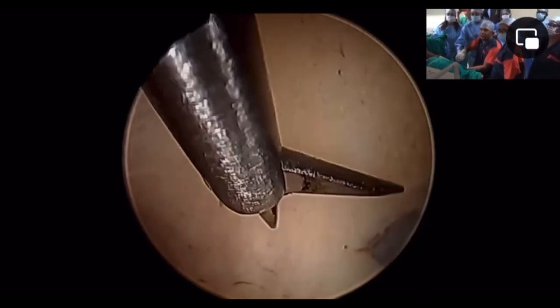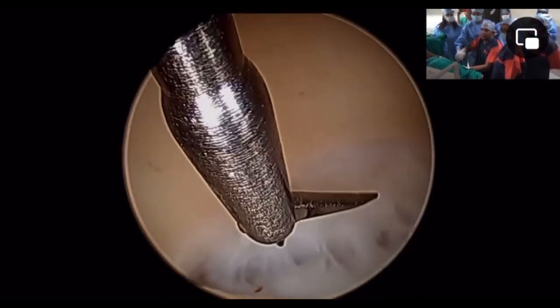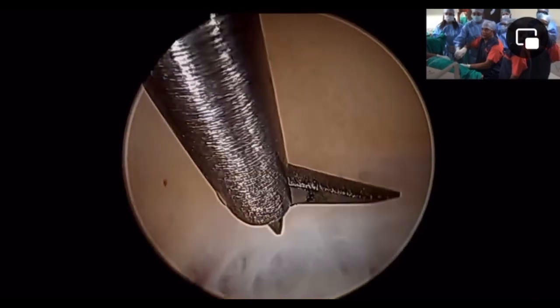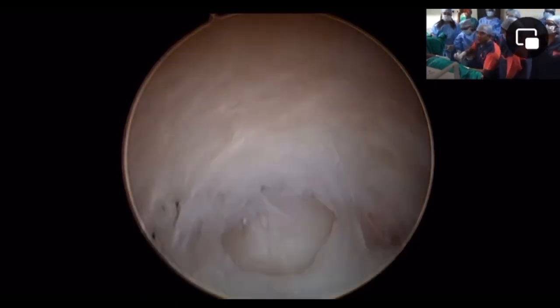And please enjoy and watch the retraction of the myometrial fibers. In fact, the myometrial fibers are under stretch because of the push of the myoma toward the cavity, and also from the other side by the fluid pressure on the opposite side. So here is a trick. Manipulating fluid pressure, oscillating the fluid pressure by increase, decrease, will help to shake the myoma and make it bulge, as you see in this video.